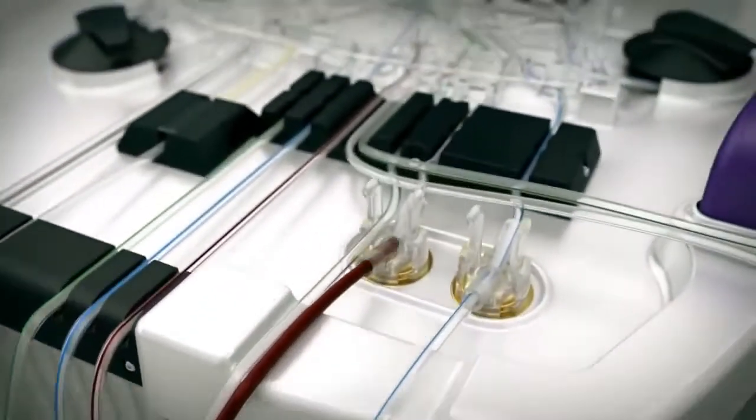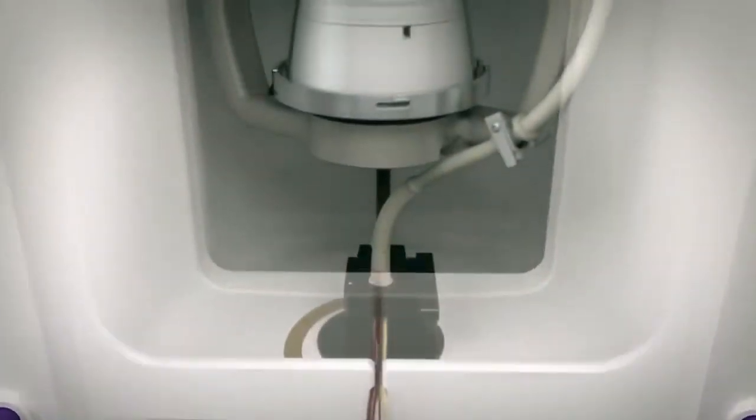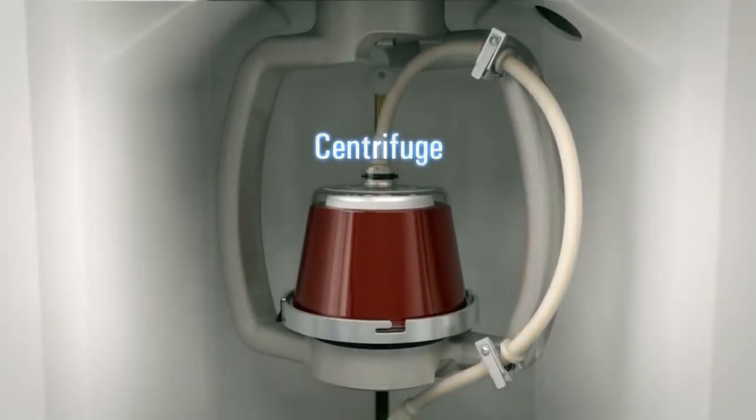The whole blood is transferred to a centrifuge where the Celex system instrument will separate the whole blood into its separate components: red blood cells, RBCs, white blood cells, and plasma.